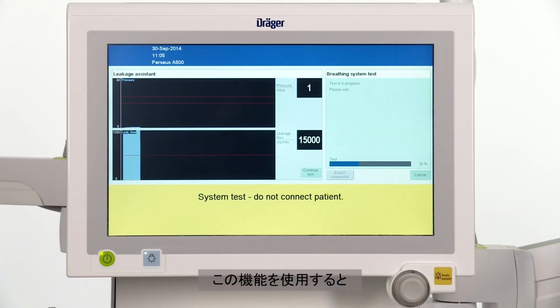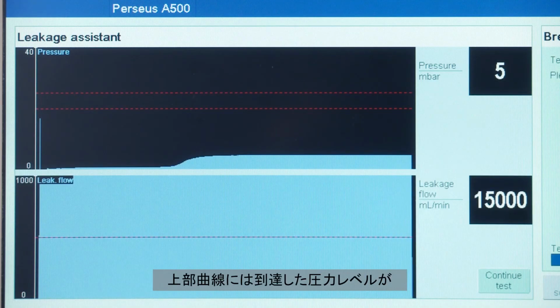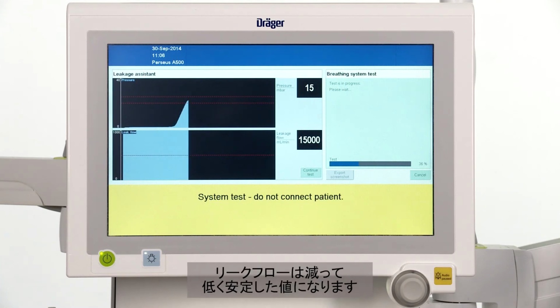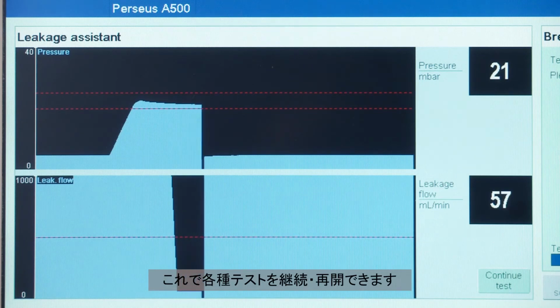When using this feature, the system will attempt to build up a continuous pressure. The upper curve shows the attained pressure level, while the lower curve displays the leakage. Once the leakage has been fixed, the pressure will rise to the target level and the leakage flow is reduced to a low, steady value. You can now continue the respective test.